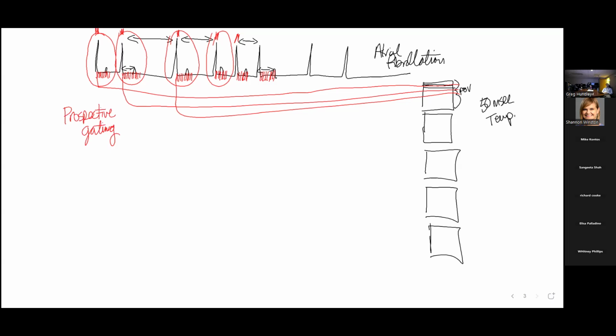And if you were to listen to the scanner, it sounds a little funky because the way it works is you hear the breathe in, breathe out, hold your breath out, and then it's going to sound like this. Every time it recognizes a QRS complex, all it's going to do is sample for a specific period of time.